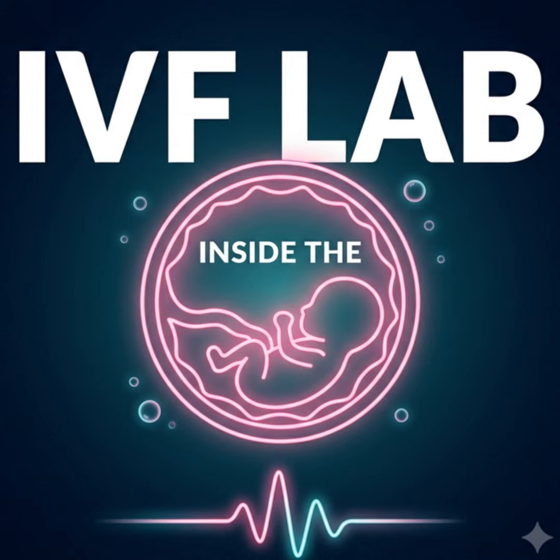It really does. To someone unfamiliar with the physics of cryobiology, it probably looks like the cell has just been destroyed. It is a visually alarming process. And it requires profound trust in the physics. But this rapid shrinking is precisely what is required.